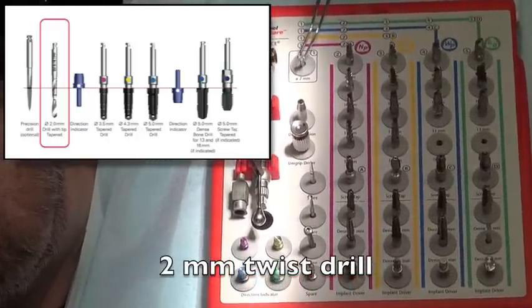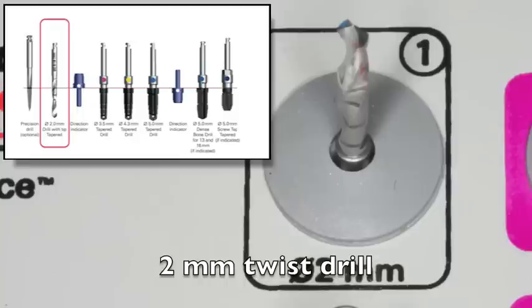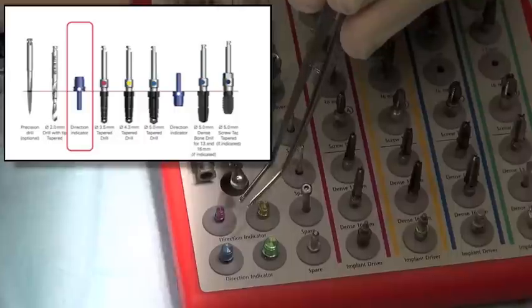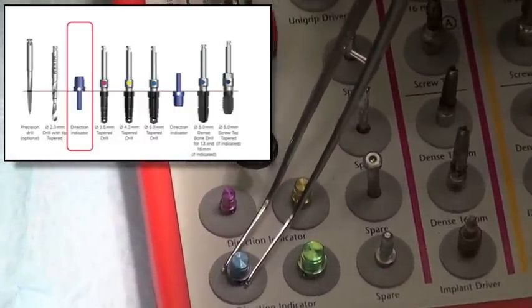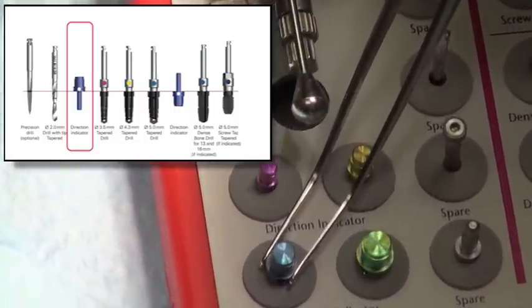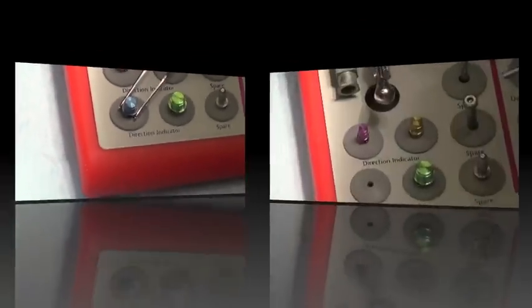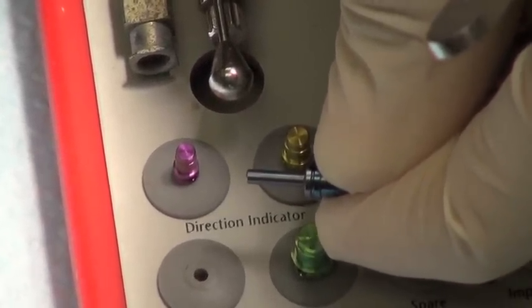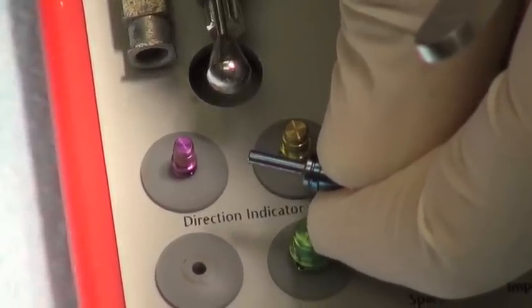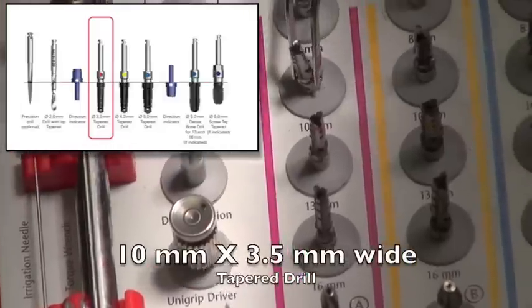Then I go to the 2mm twist drill, which is a drill that's going to get you your initial length — a great start to the whole osteotomy. We go to a direction indicator and take an x-ray to make sure you're online. The direction indicator post is about 8mm long, which allows you to see angulation and also depth of the osteotomy, so you can measure off nerves and sinuses.